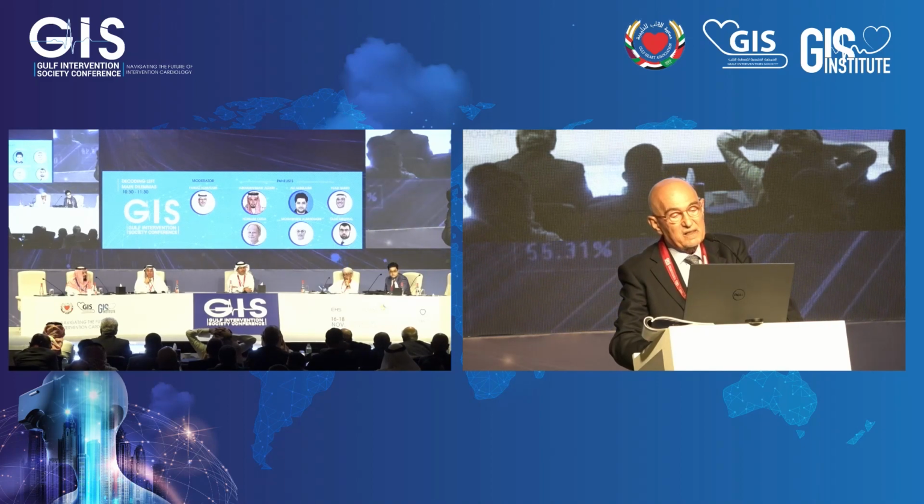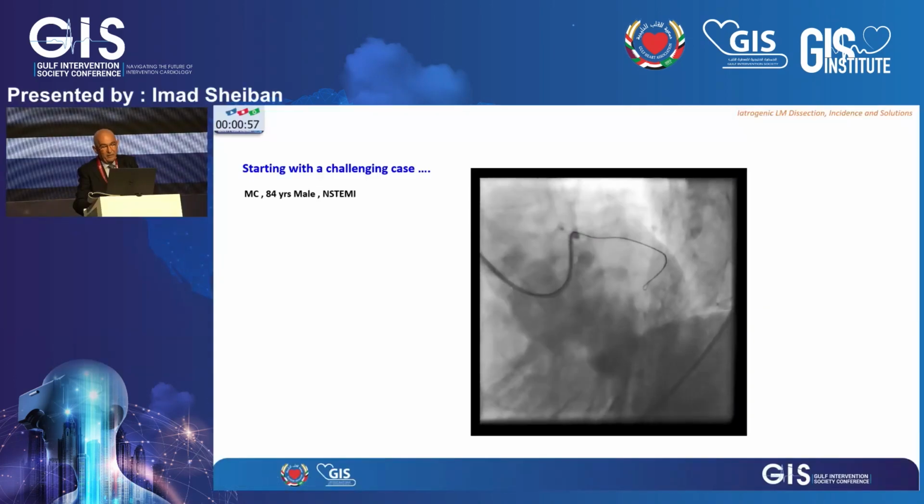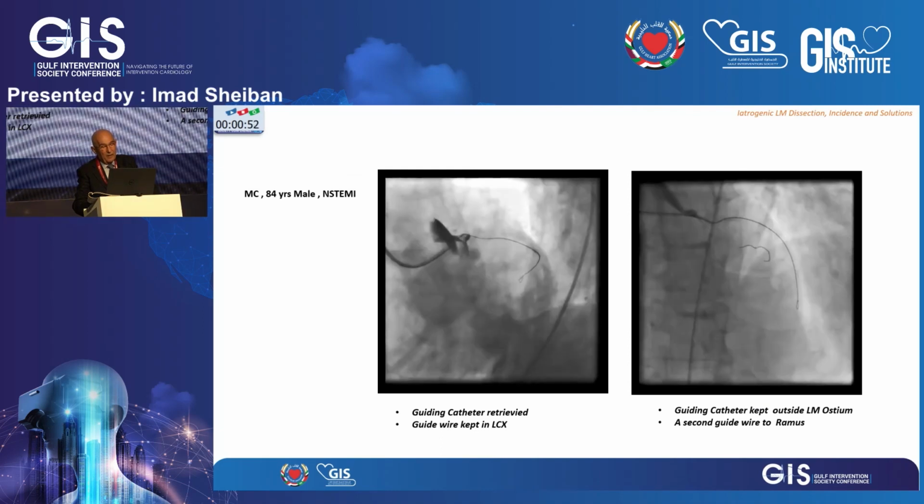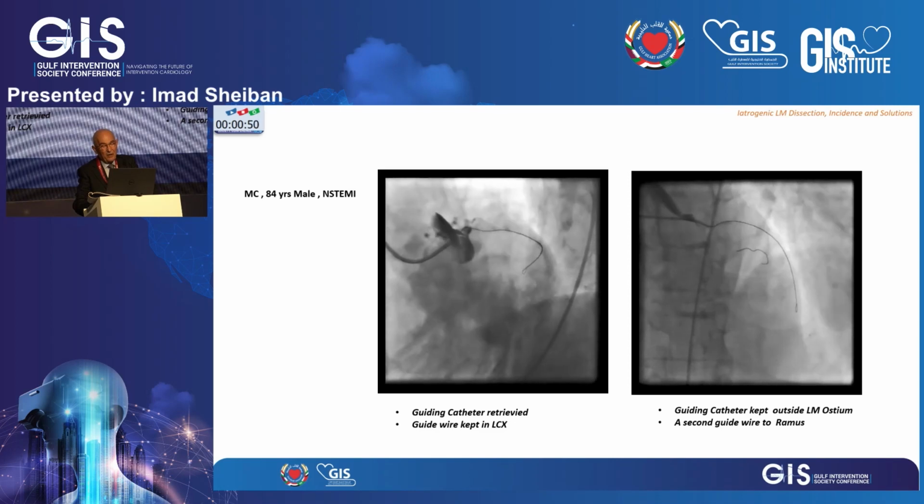Yeah, pushing against the wall of left main, and you can see here the dissection is extended to the aorta, less than 40 millimeters.